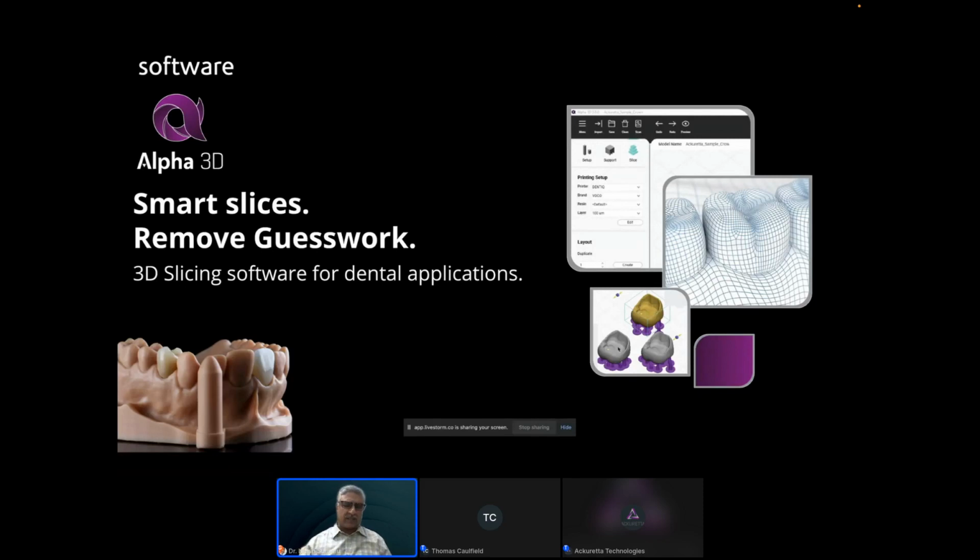So you print a slice at a time, pretty much, and these slices are spaced apart by 50 microns, 75 microns, 100 microns, whatever. Now, 50 micron prints are generally higher resolution than a 100 micron print. That's not necessarily beneficial always, but in general, you would use a higher resolution for more accurate printing. So the software does all that slicing for you.